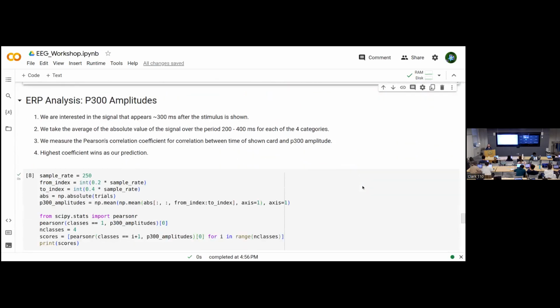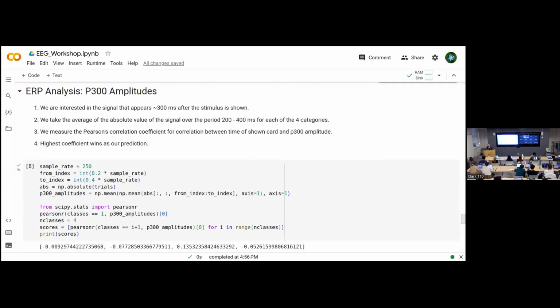And so ERP is actually not a particular type of signal. It stands for event-related potential. And actually, there are many different kinds of ERP signal. If you just do a Google search for different kinds of ERP, you're going to get many of them. They're essentially a particular differentiating signal that we notice corresponding to a specific event.